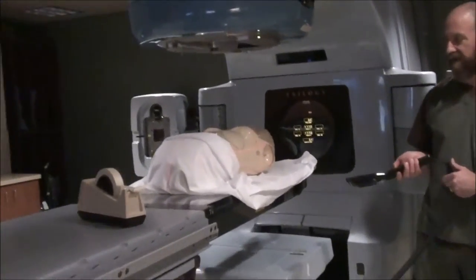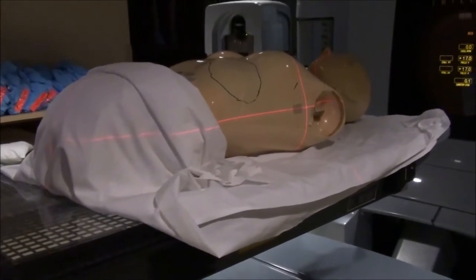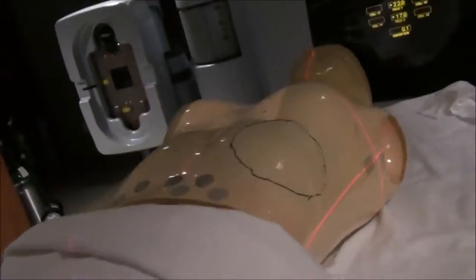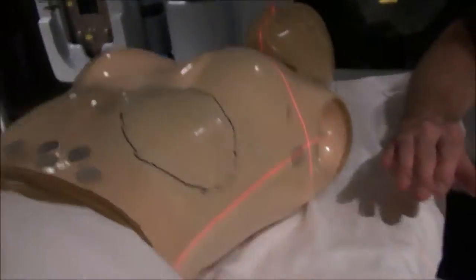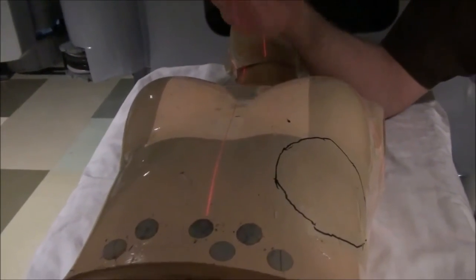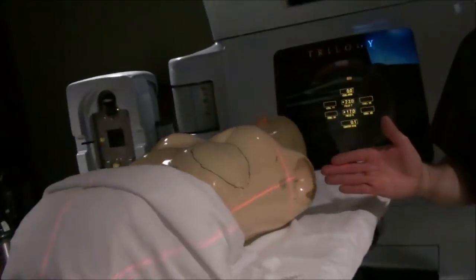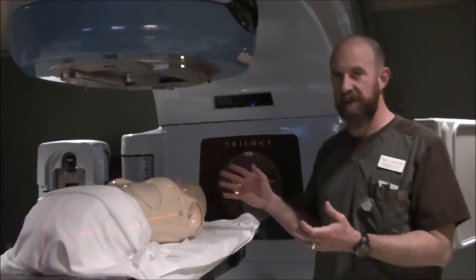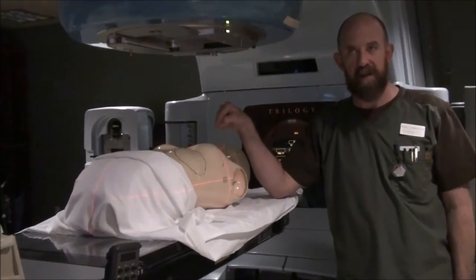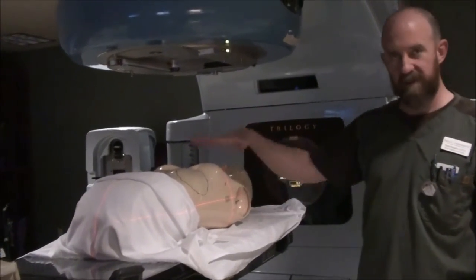We're going to center in the middle of her chest for this particular example, and take her up to about midline. We've got a relatively large field set here — we're going to make it even larger. We've set it basically to mid-plane up-down and mid-plane left-right as a nice starting point, treating her as a primary mediastinal cancer. Once you've got that set, go ahead and fluoro. The doctor will set the field size, determine exactly how big she wants the field, and then you'll notate everything — this is essentially a basic AP-PA lung, including the vertical.